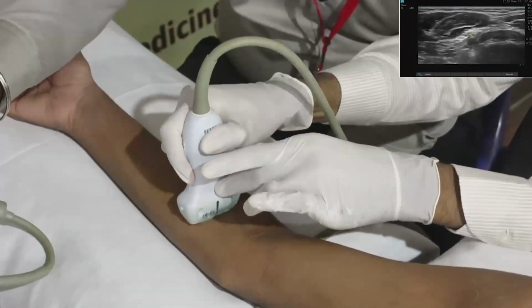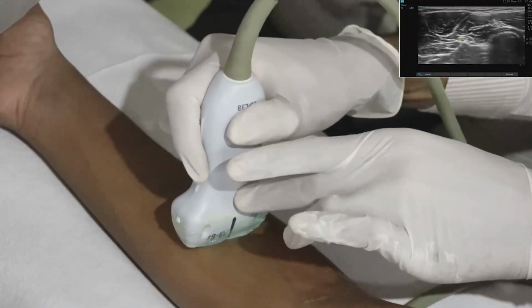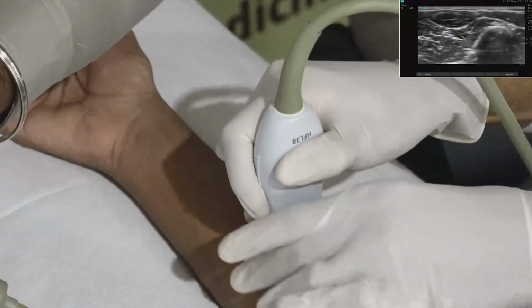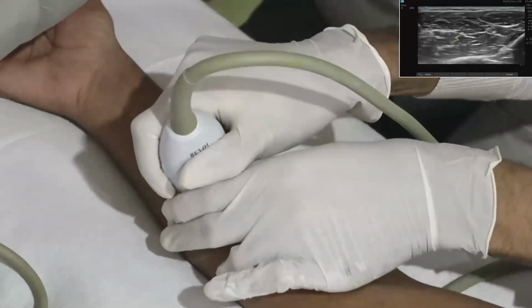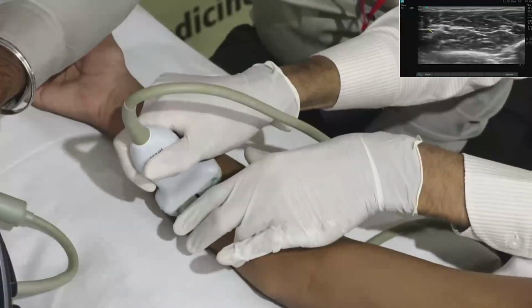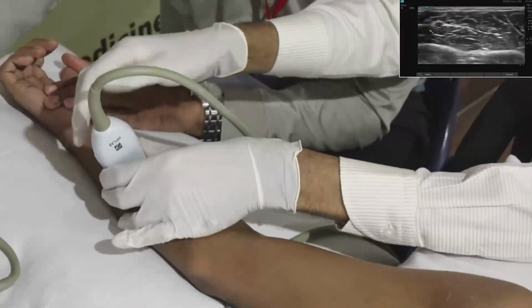So it is coming and lying between the two muscles, that is flexor digitorum superficialis and flexor digitorum profundus. Here we get one panoramic view. If you move the probe laterally, we see one pulsating artery, that is ulnar artery. One marker is medial.